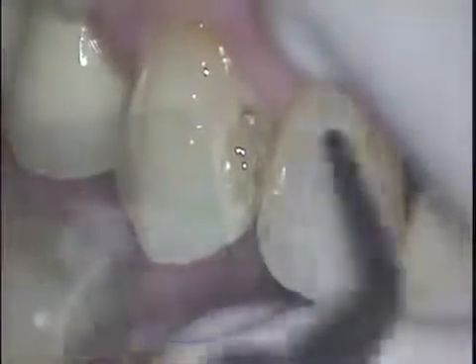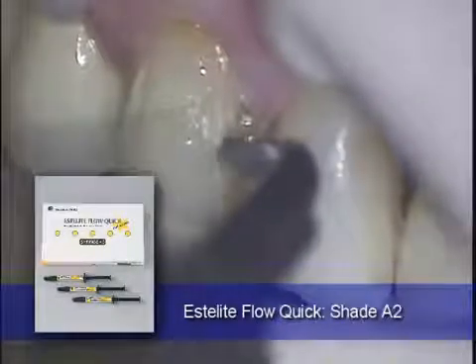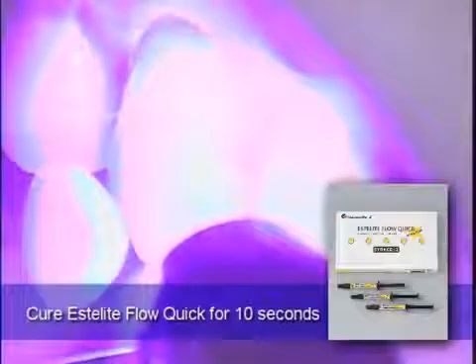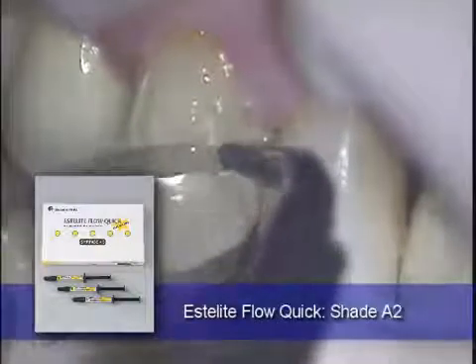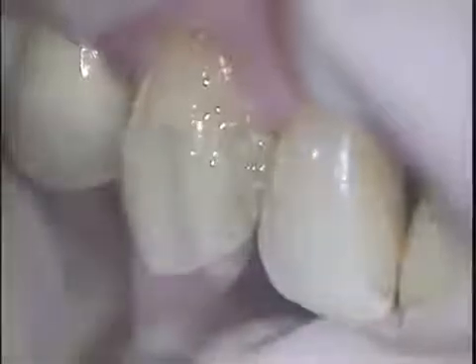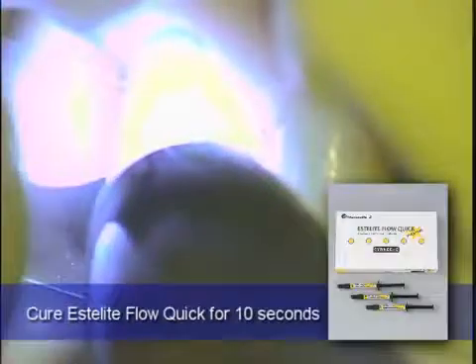Following this placement, the Estelite Flow Quick is syringed through a hole previously created in the mylar strip, and is cured for 10 seconds. This step is again repeated until the majority of the cavity preparation is filled. The final incremental layer is placed into the preparation and the mylar strip pulled over the facial surface of the tooth in order to provide a complete fill. Should this be inadequate, additional layers of Estelite Flow Quick can be applied.